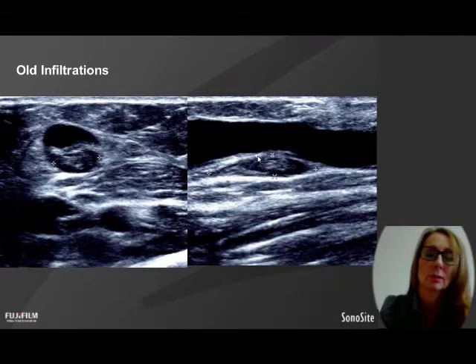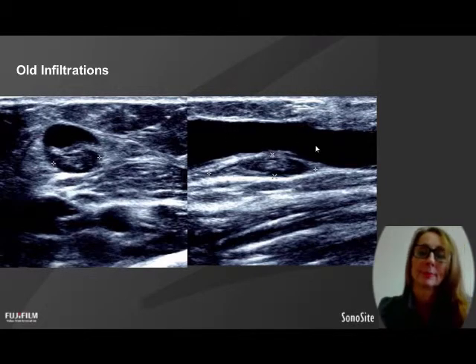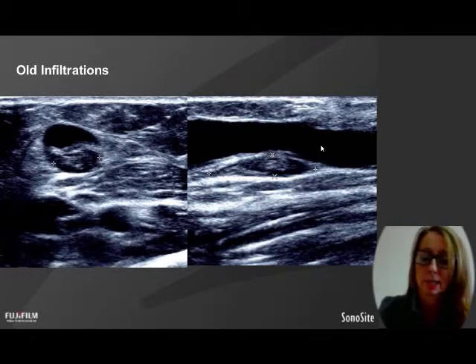So having the ultrasound from the start would help us to decide to probably go over here instead and avoid that, or use good tourniquet and puncture here and then be able to watch ourselves thread through this lumen and out to the other side. So that really does minimise the impact, because if we continue to puncture there and re-puncture that back wall, that would set us up for failure for many, many weeks.